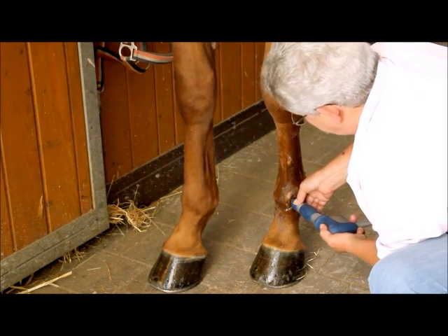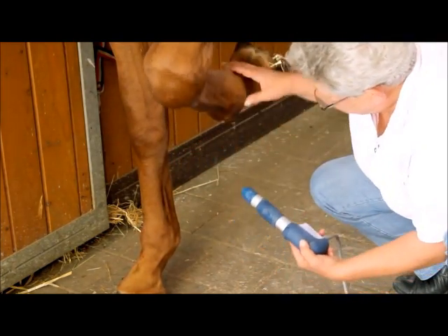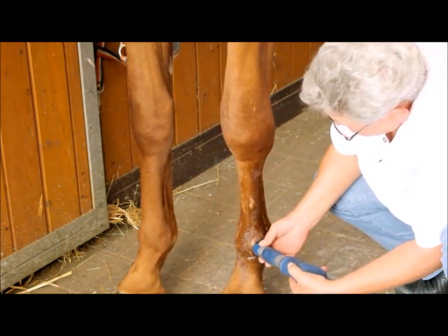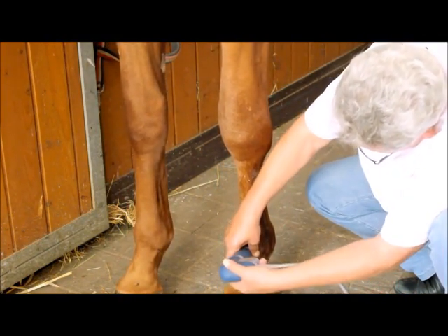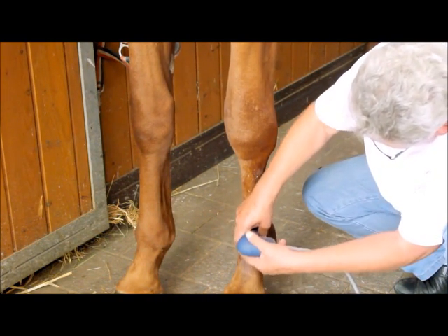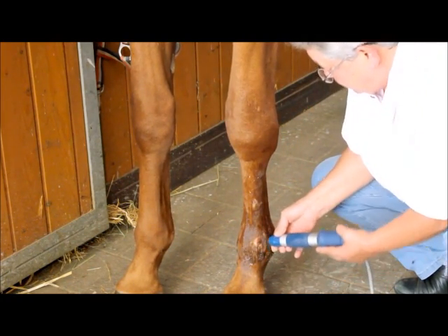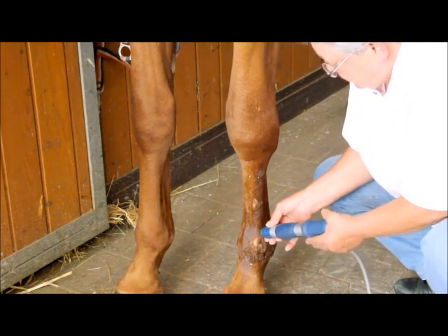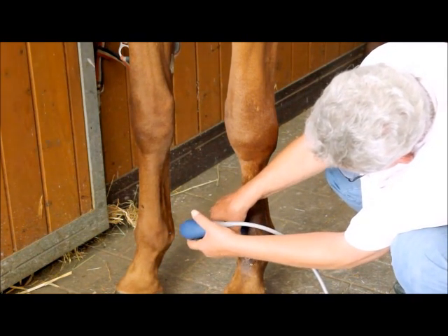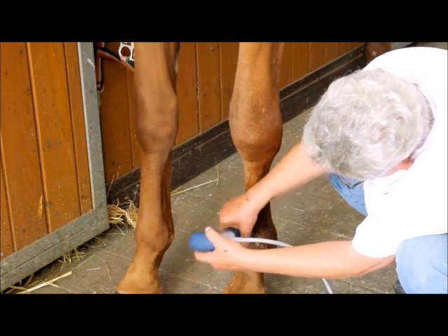What are the benefits for the horse owners? Actually, the cost. If you treat a horse manually, it takes you a long time. With the shockwave, you minimize the cost for the owner. What's the benefit for you? You can offer better, higher technology — the results are better. I use it focused on the problems which I find in the horse.